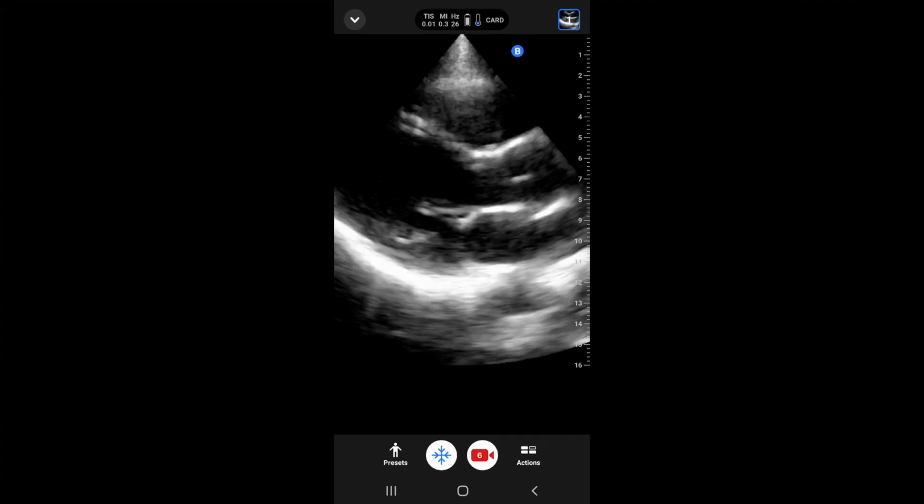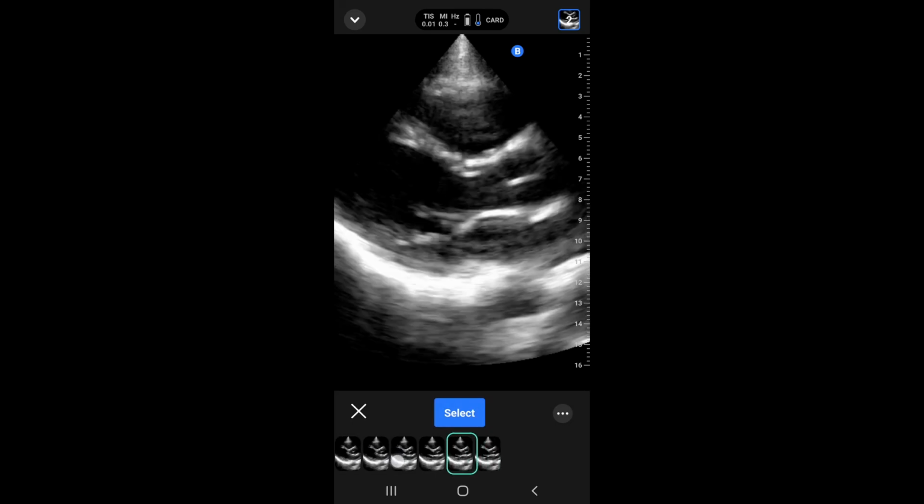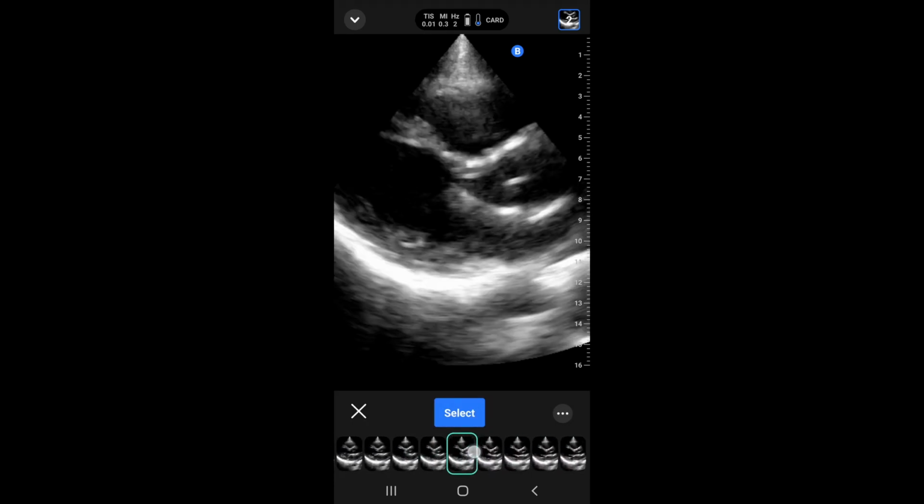That's probably what you'll do for most of your scanning, but you could also save a still image if you wanted, like a freeze frame or a screenshot. To do this, tap the snowflake button to freeze the image, and then tap the camera button to take a picture. And if the perfect image just slipped past you, tap the little clock on the left. This lets you scroll through the images you just saw so that you can go back and select the best one.